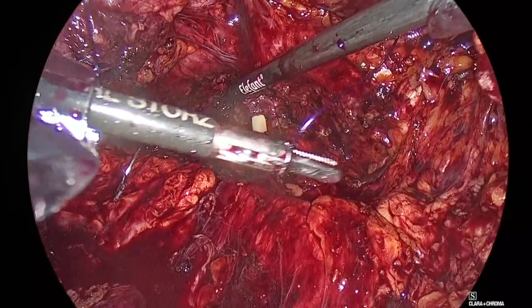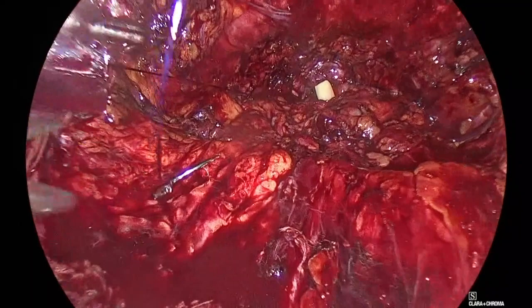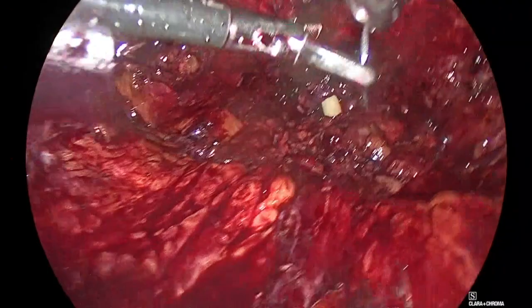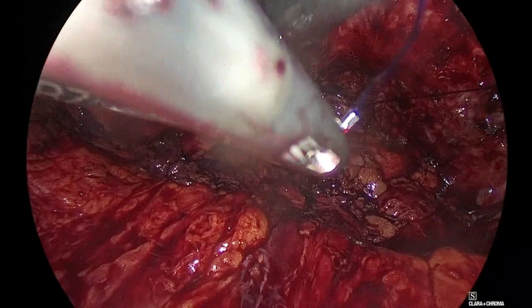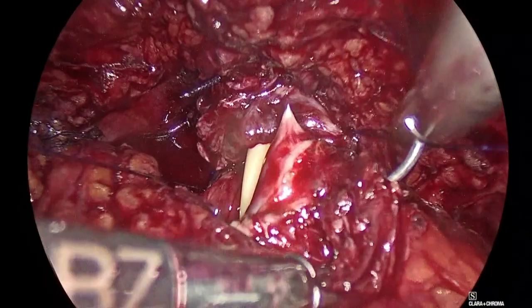Wait. You're pushing. Evangelos, do you have any particular suggestion in case the meatus is near the suture, in order to avoid problems? If the meatus is very close, then what you need to do is to be very close and rotate the other side. There. You have to be very careful on the bladder. Take a thicker bite on the muscle and very close to the mucosa.